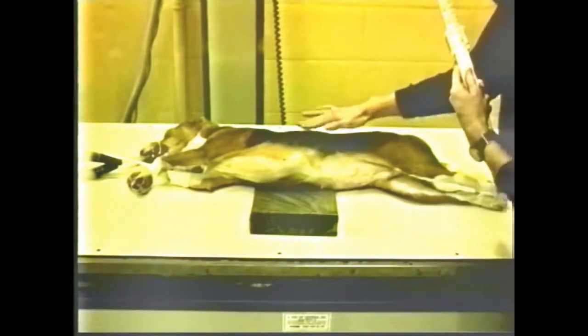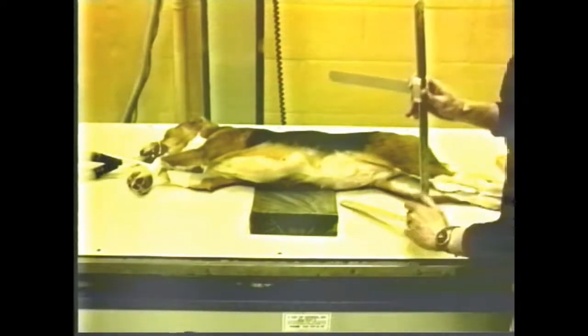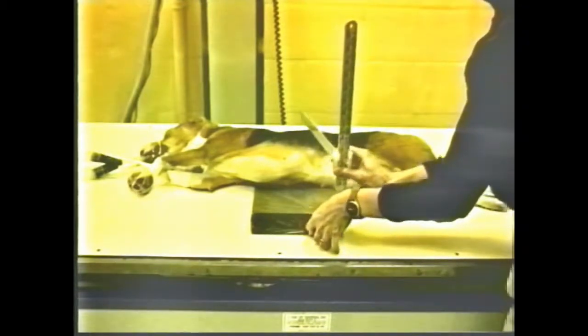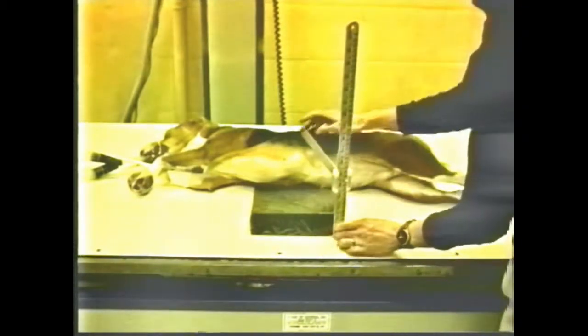The measurement is taken over the greatest bow of the ribs, since the thickest portion needs to be penetrated so that the film will be dark enough for proper examination.